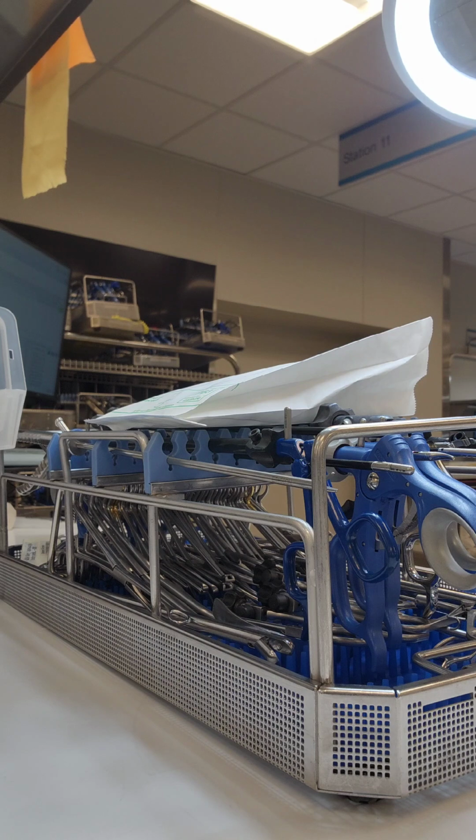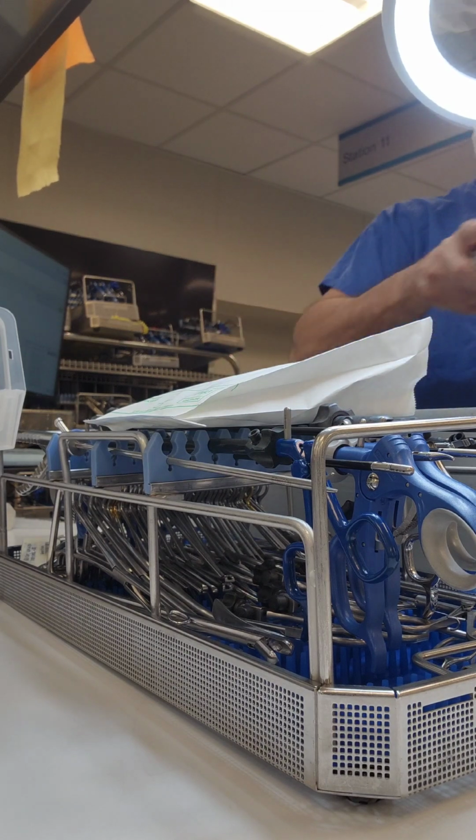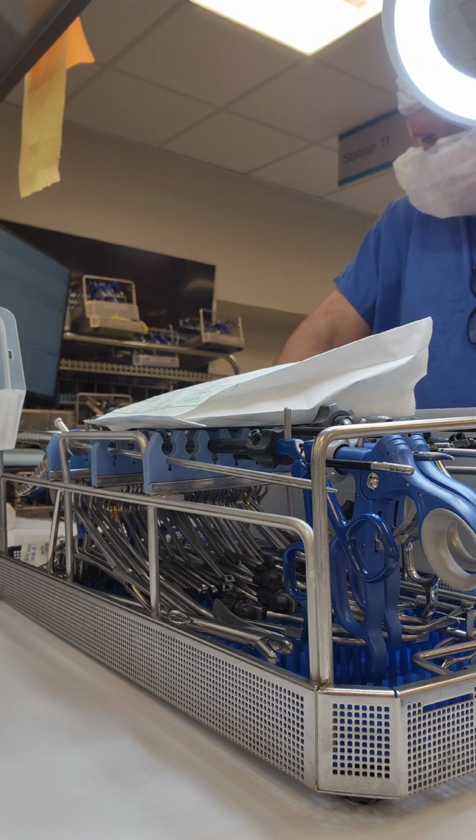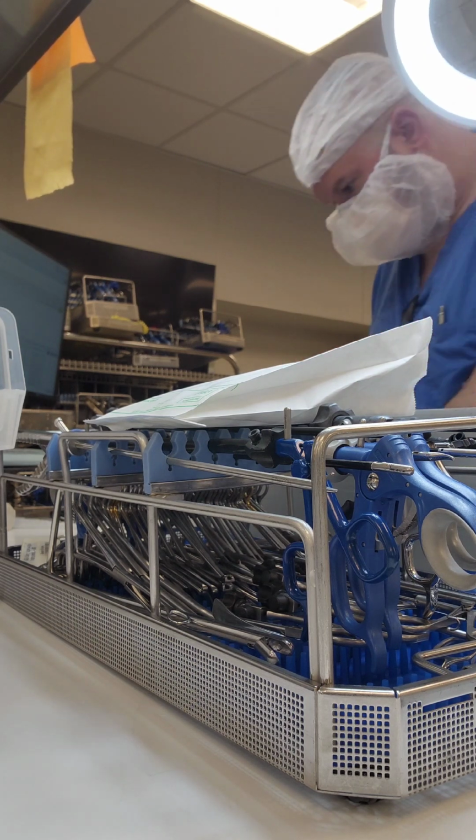A couple seconds off the clock here that I could have taken off if I'd grabbed the right basket for this container. And then you'll see when I try to put this in the container that I had to rearrange some stuff in there so that the lid can fit. This container that I got was actually a perforated bottom container, so when you put the basket in there, it actually makes the basket sit a little bit higher than usual. So that was an issue as well.